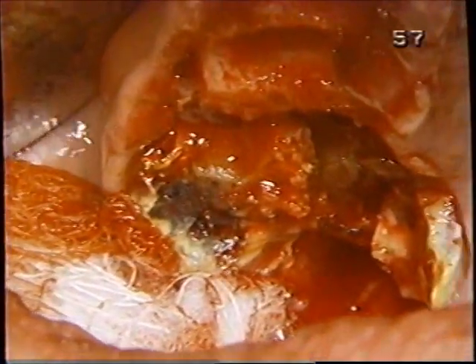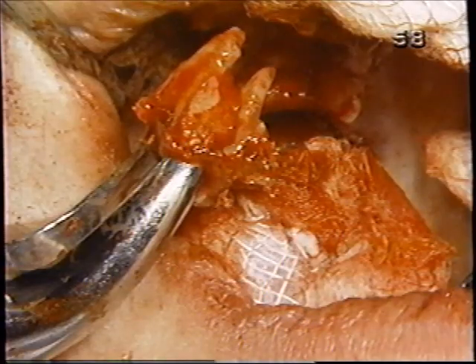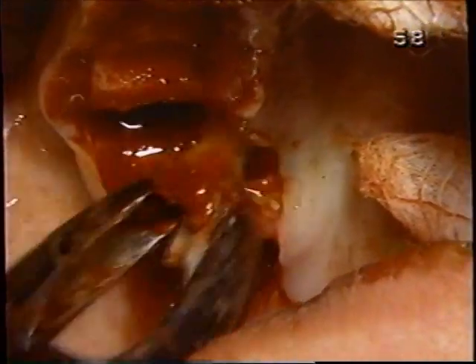What we're going to do now is use the palatal root as a fulcrum and try to take out the facial. Her age, I think, is contributing to a little bit of bone loss.